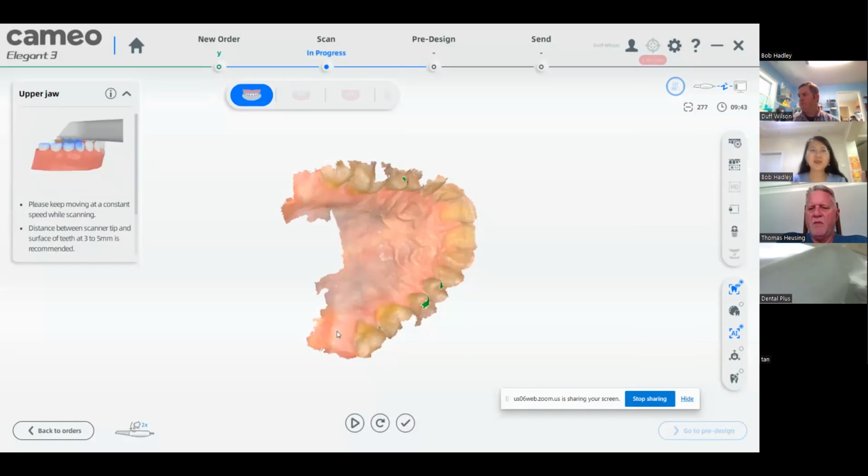Okay, so I don't know the name of the guy, but he asked, if we have some scanners for our doctors, can Duff come out and install and do training for free? Can I address this, please? Actually, when it comes to training of your doctors, you will be responsible for training your doctors. We can give you online sources for that with Duff. However, it isn't feasible for us to send Duff out to each doctor to do a training.